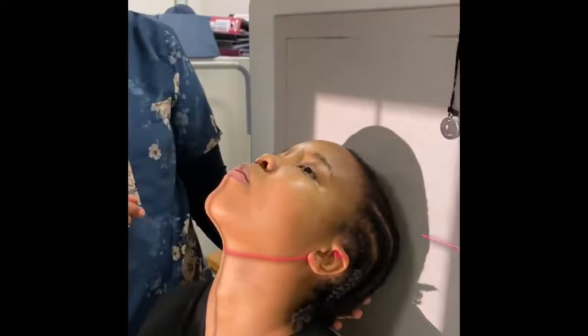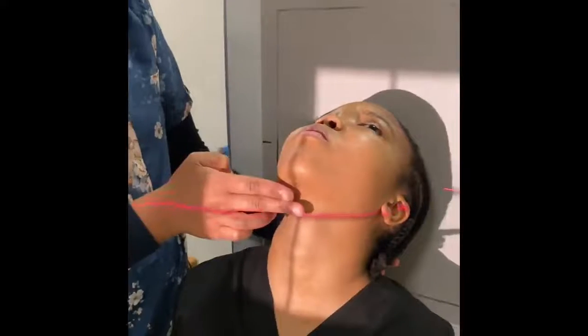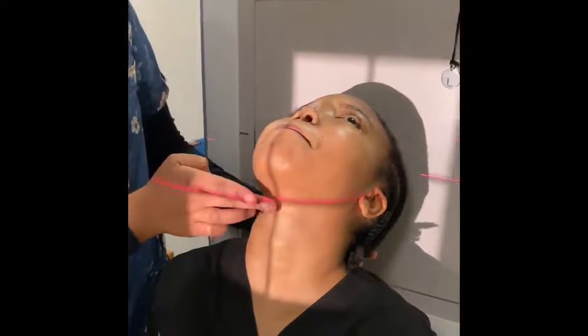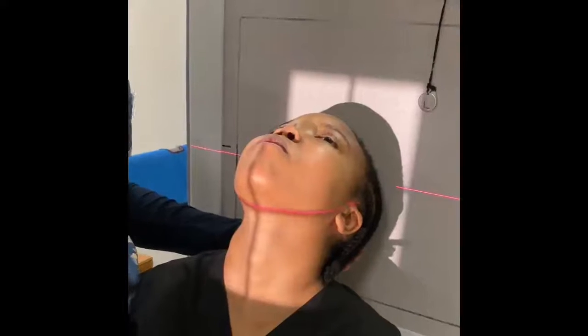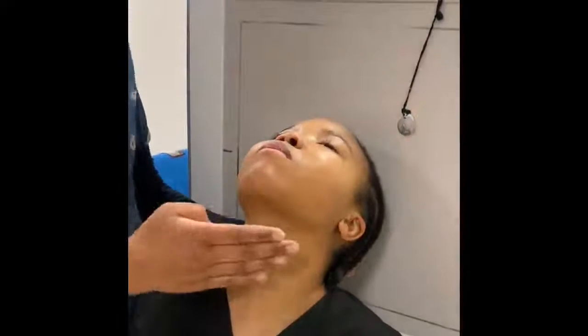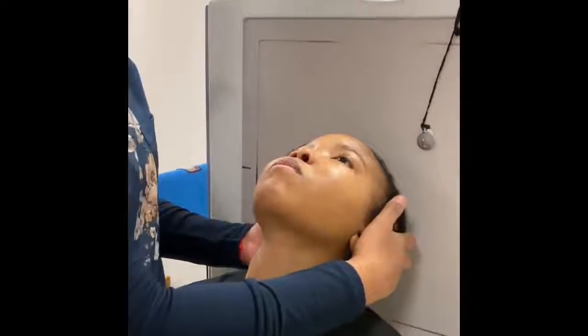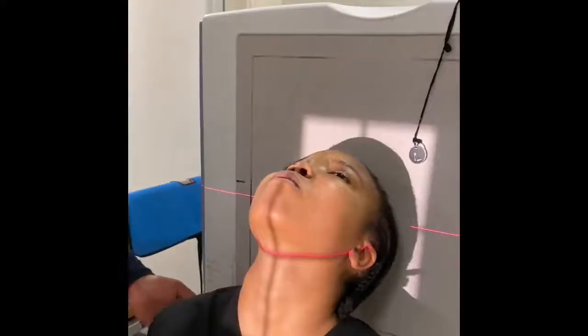And then in terms of centering, we're centering about 4 centimeters below or inferior to the mandibular symphysis in the mid-sagittal plane. Remember that you would need to collimate as well as place your marker readable on the side that we are demonstrating. Try and make sure that there's no rotation or tilting, and that's basically your SMV positioning.